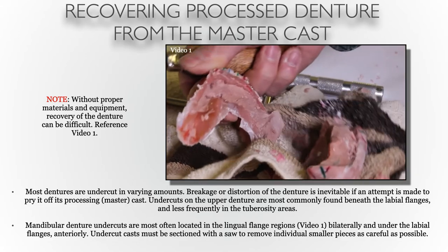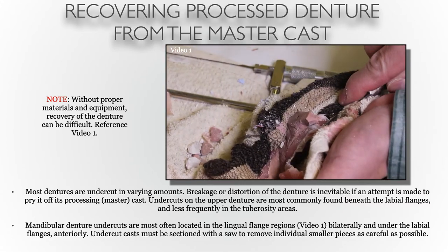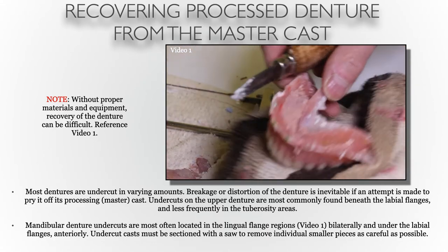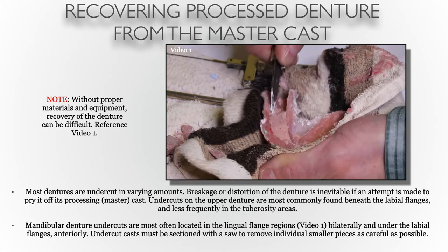Now if a denture has significant undercuts as you see in this video, the majority of the stone will be stuck inside of the intaglio surface. Some of it will be removed with a knife easily. Other portions without a pneumatic chisel can prove to be very difficult, but we'll talk about this more in an instructional video that goes along with this week's session in your laboratory section.